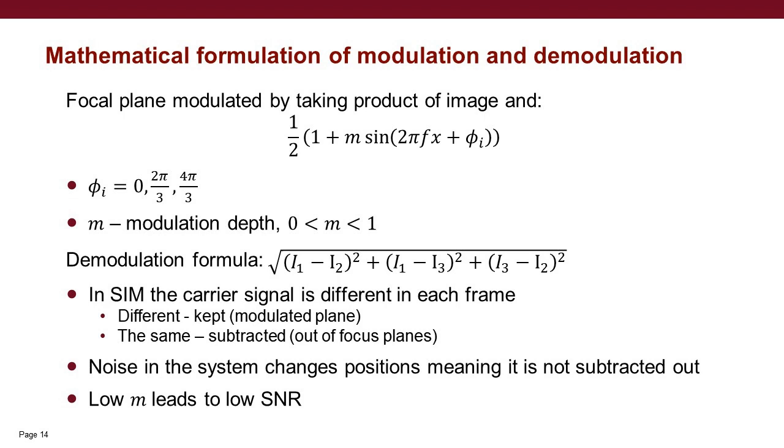So going back to the sine waves, where it's modulated, where the blue line is really pronounced on the intensity profile page, you're going to be reconstructing that plane. You're going to be reconstructing it very well, but where you have really imperfect modulation and it's out of focus and it's blurred, you're not going to be reconstructing that at all. So your final image is only going to have components that are different, so where the modulation is different, the carrier is different.